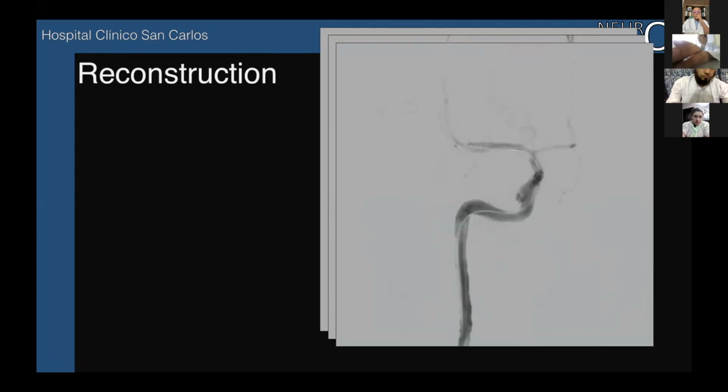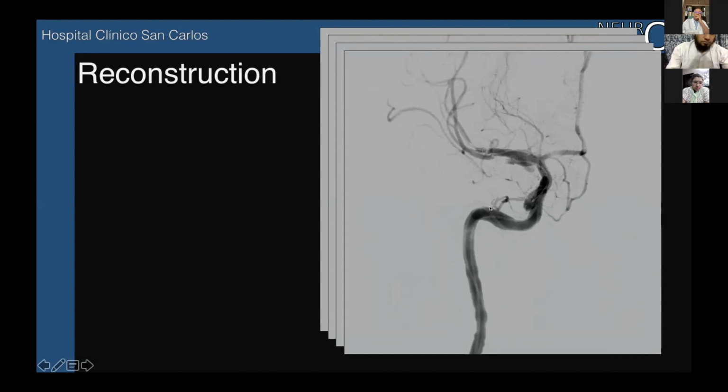This is the control. You improve the spasm in the middle cerebral artery, stop the flow in this part, improve the spasm in the A1 anterior cerebral artery. But in the later phase, you have some false aneurysm or dissection or bleeding. I decide it's not good. I wait.